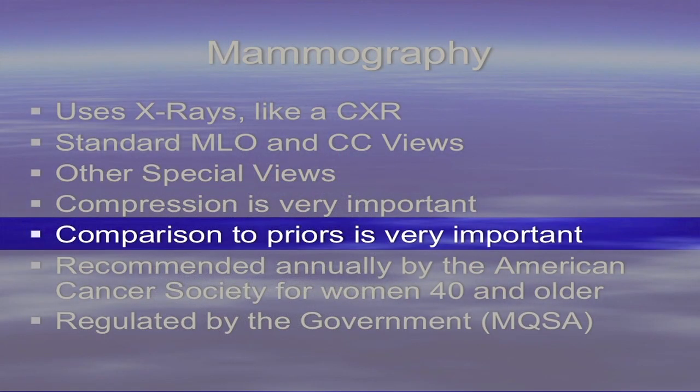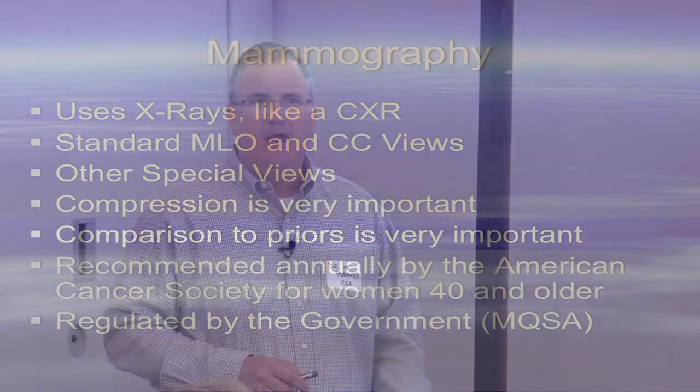As we mentioned to someone earlier today, comparison to priors is very important. We know when someone has their first mammogram, or a mammogram is performed without comparisons, the rate of callback is always greater, because we don't really know if that's just the way the breast was made, the way it developed, or if there's something new in there. So we tend to be a little more cautious, a little more worried when we see something on a mammogram that doesn't have comparisons, to make sure that we're not missing something new that we just haven't imaged before.